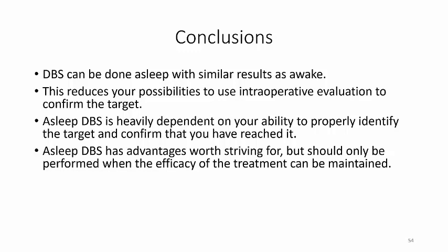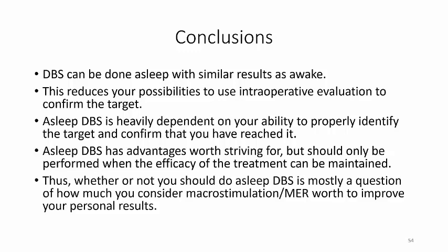Asleep DBS has advantages worth striving for, but should only be performed when the efficacy of the treatment can be maintained. Thus, whether or not you should do asleep DBS is mostly a question of how much you consider macrostimulation or recording worth to improve your personal results.